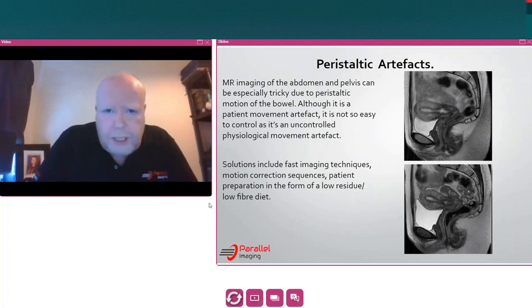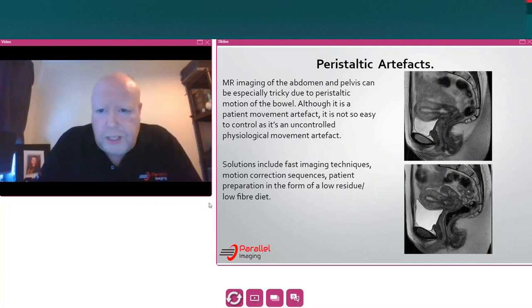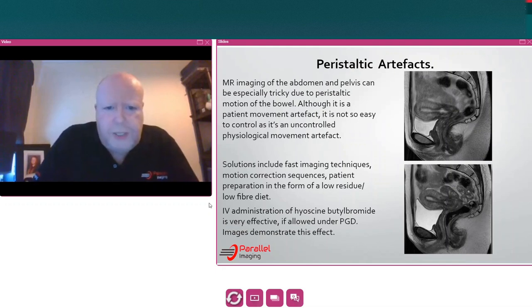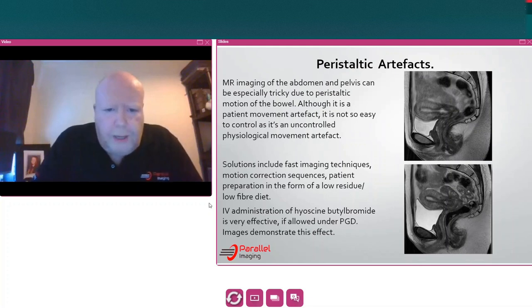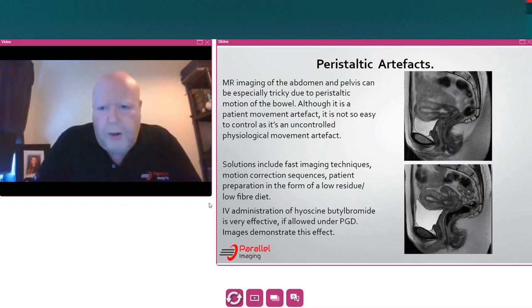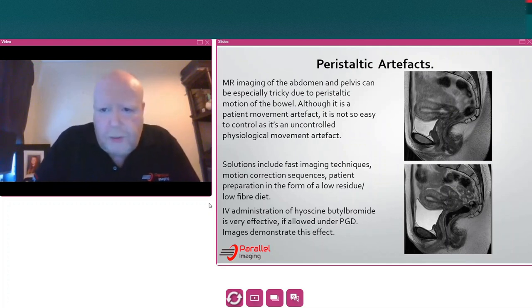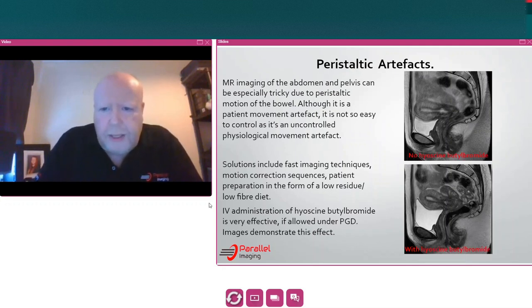Another technique is the IV administration of hyoscine-butyl bromide, demonstrated on the images on the right-hand side. This is a smooth muscle relaxant drug and it's very effective. It is only allowed under certain PGDs — patient group directives — and may not be appropriate in the country you're practising in. On the right-hand side, the top image is without hyoscine-butyl bromide, and the second image is the same patient about five minutes later after administration. It does help quite a lot.